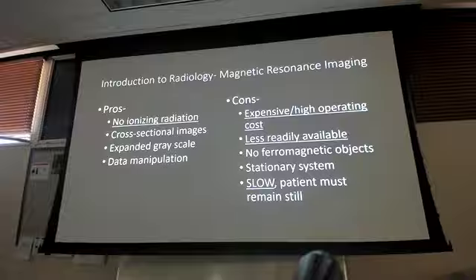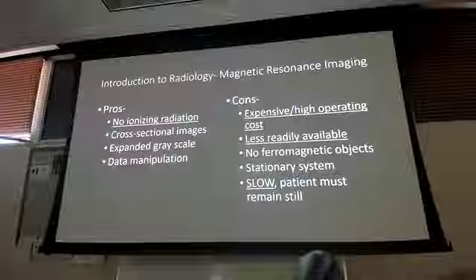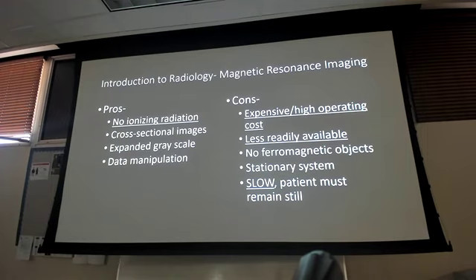Okay. It's a stationary system. That's a con. It's also, sorry, thank you. Going back to the magnetic. Yeah. It can be turned off if electromagnets. Say it again? Can it be turned off in emergencies? Like say someone with metal enters a room. Oh, okay, so good question, right? So it's constantly going, but it's not constantly going, right? So they do have an emergency stop button, like if a patient starts screaming or whatever.